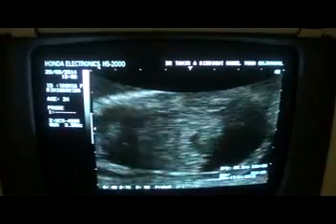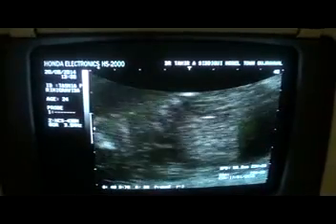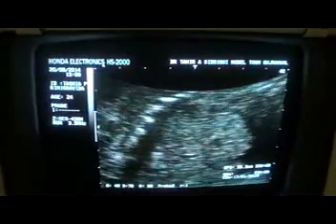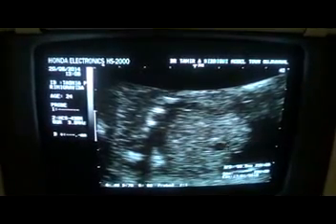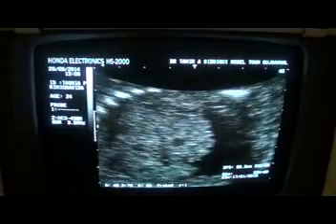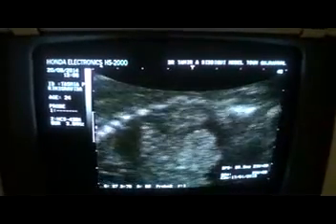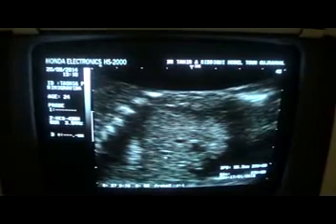To show you abdominal structures. Now this is the liver. This structure that is in view is the fetal liver. This is the liver, and these are the matted bowel segments. You see, these are matted bowels. Rest, you can see the movements are seen. Fetal movements are visualized. This is the portal vein.